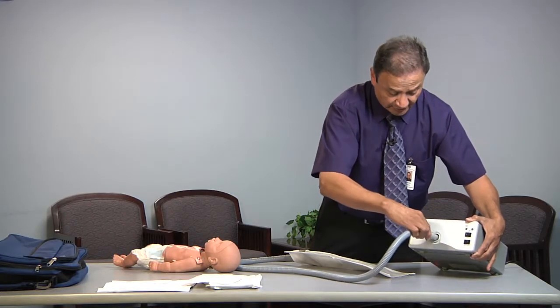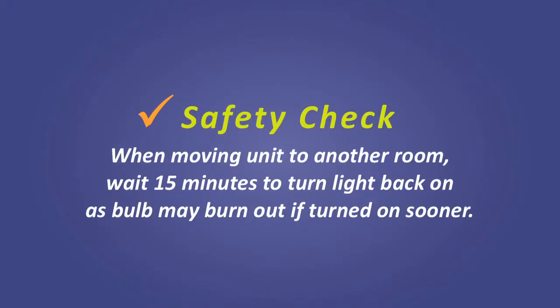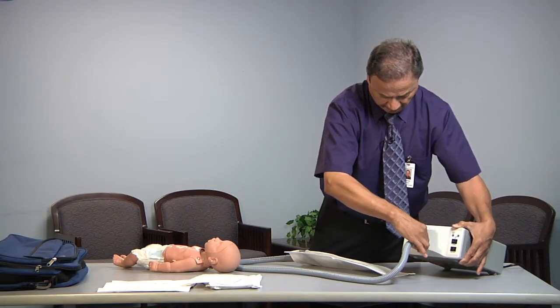So if you pull it out and you want to go to another area, like down into your living area, basically, when you shut the machine off, we have to wait 15 to 20 minutes before we turn it back on because the bulb gets really warm. But when you take it out, you can just turn this till it pops out here. Okay.